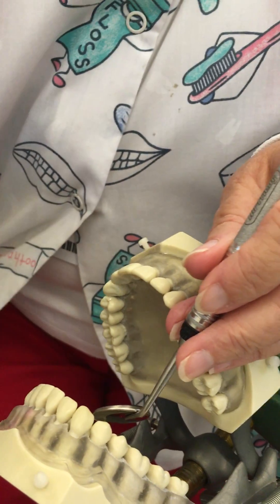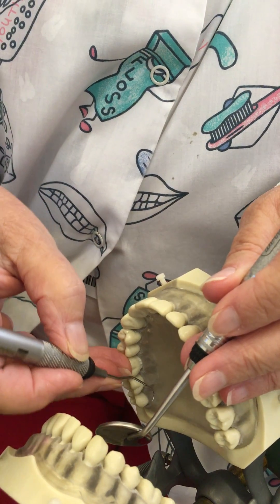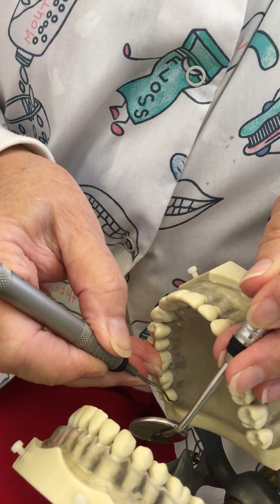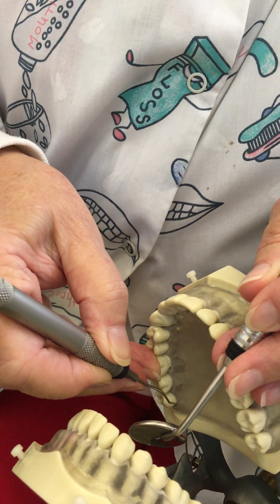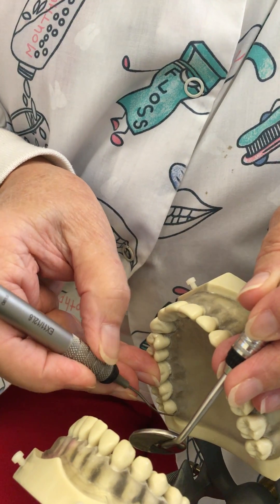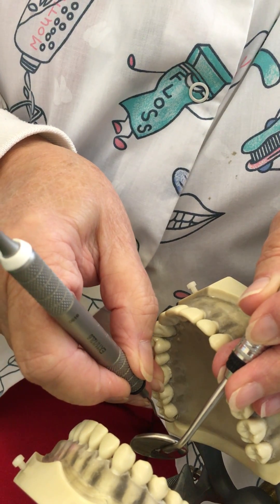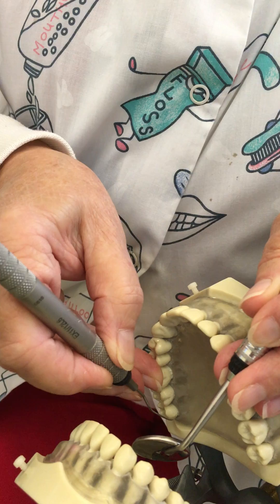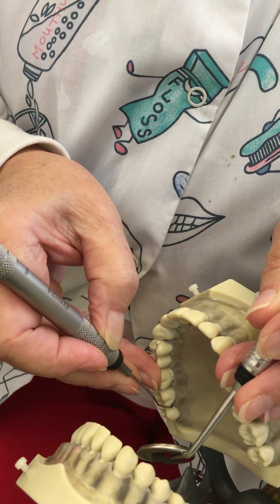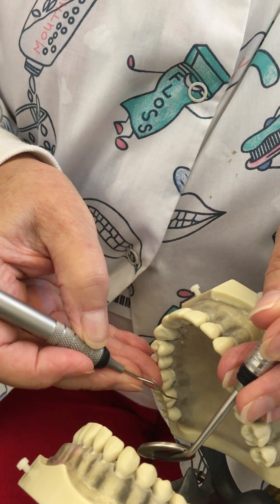I've piggybacked to my fulcrum. I'm going to extend the instrument in my hand, lean toward the lingual, roll over my fulcrum, and place my toe at the distal line angle and go. When I'm done, I'll turn my toe in the toward direction, start at the distal line angle using oblique strokes overlapping one another, and come around to the mesial. That's about as parallel as I'm going to get, and that's okay because this instrument is designed that way.